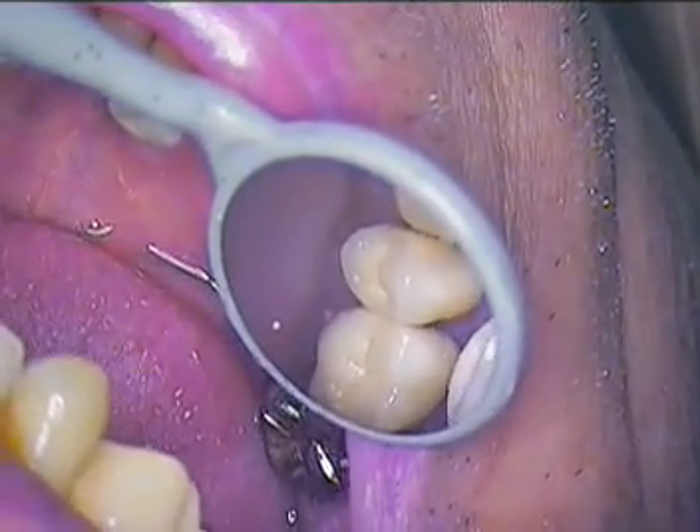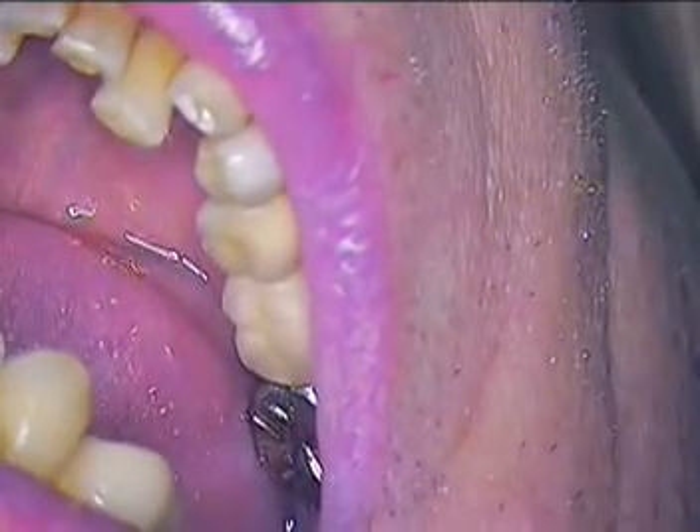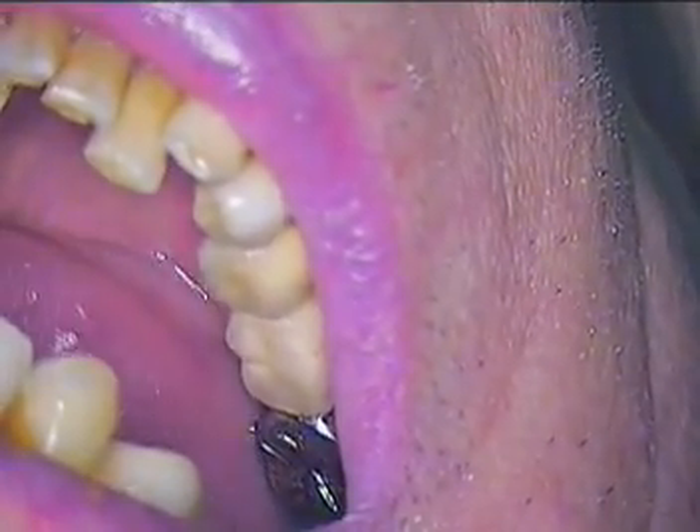We're also going to be placing some wax in between some of these teeth. Jerry Cuomo signing off — I'll pick it up on the next step.